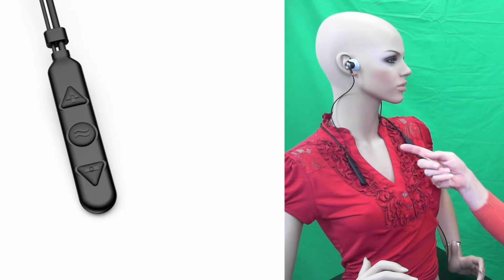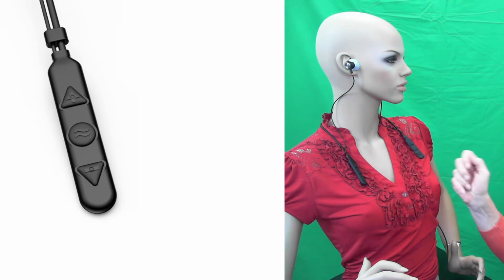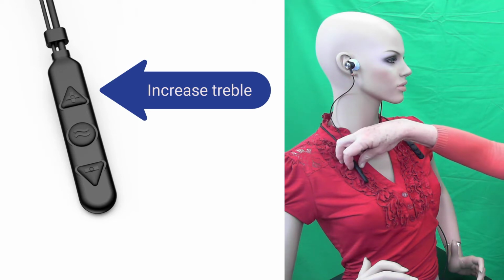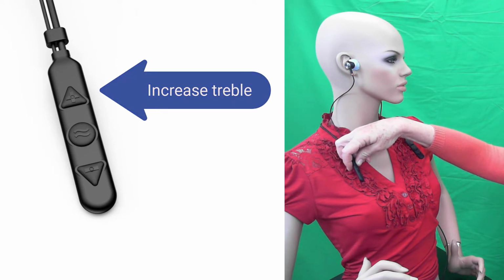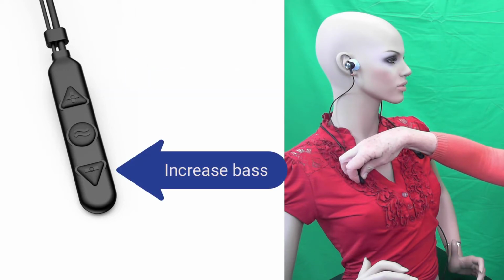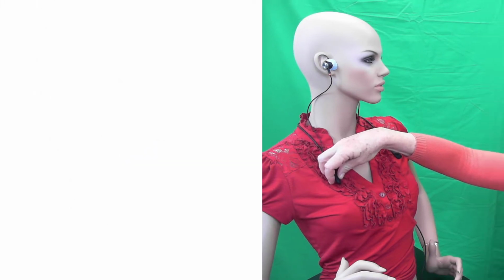To support the tone control feature in the headset, we have modified the right-hand control box buttons as follows. Pressing the top plus button will increase the emphasis on the higher or treble frequencies. Pressing the bottom button, the minus, will gradually place more emphasis on lower or bass frequencies. Did you hear the difference?